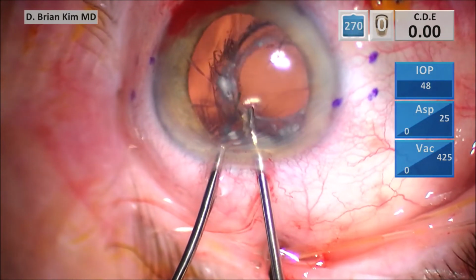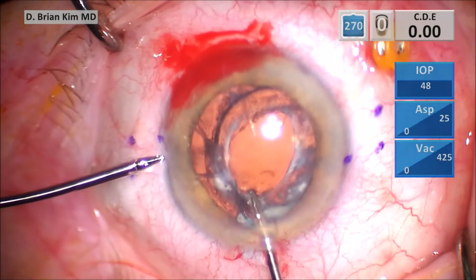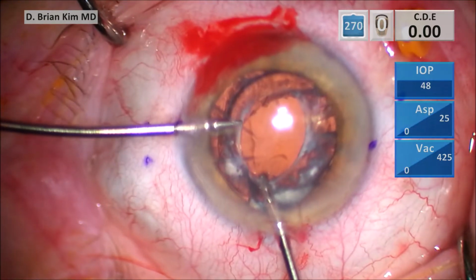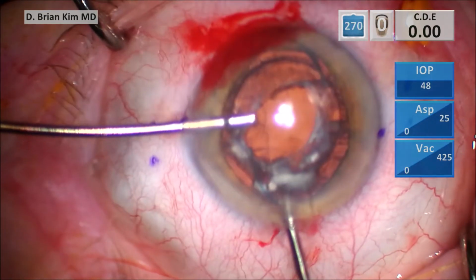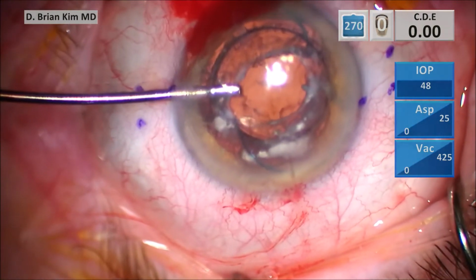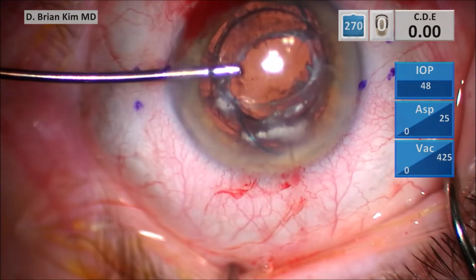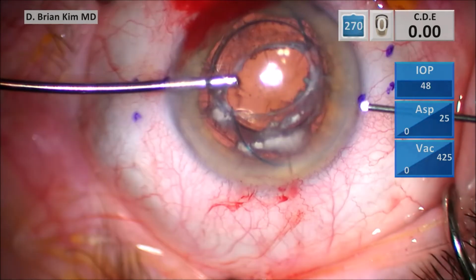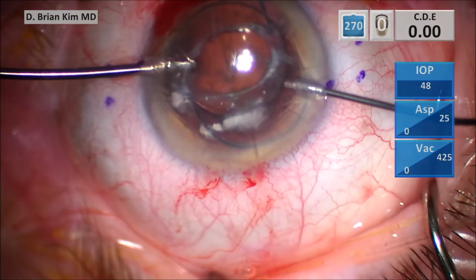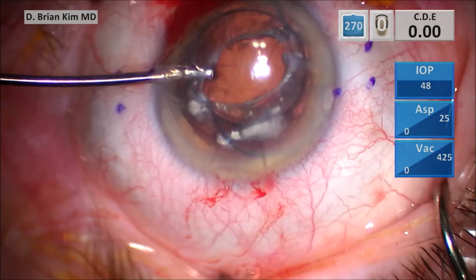So in this case, I have 2 IOL holders. One in the right hand, one in the left hand, and now I decide to grab the optic, and then I switch hands, go through the para on the left side, and then I'm going to go ahead and grab the optic a little bit better, kind of like a handshake technique here. Now that I have good grasp with the left hand, while I'm holding the lens, I go ahead and push some more dispersive viscoelastic to coat the corneal endothelium. And then now I'm going to cut the lens.